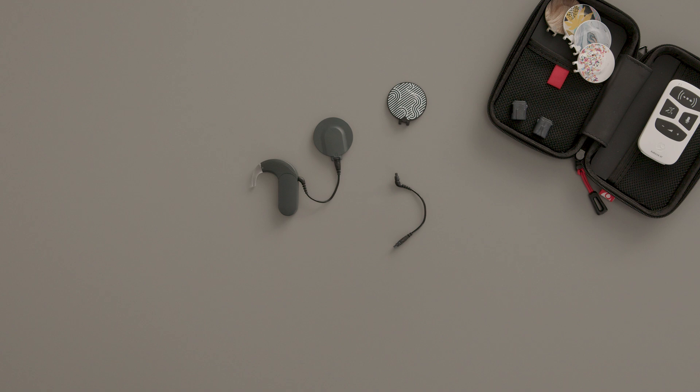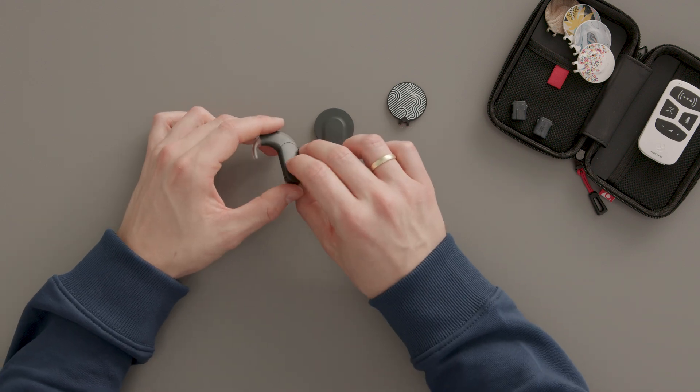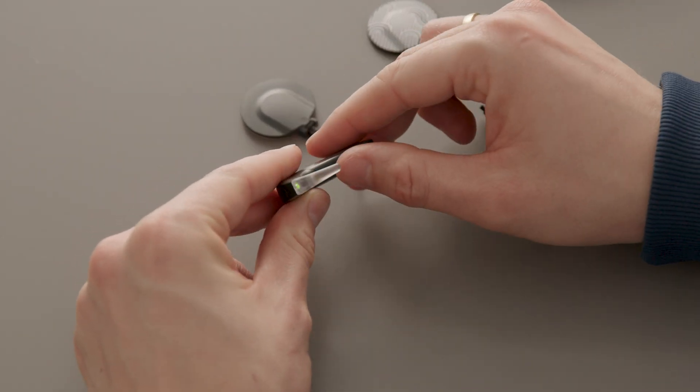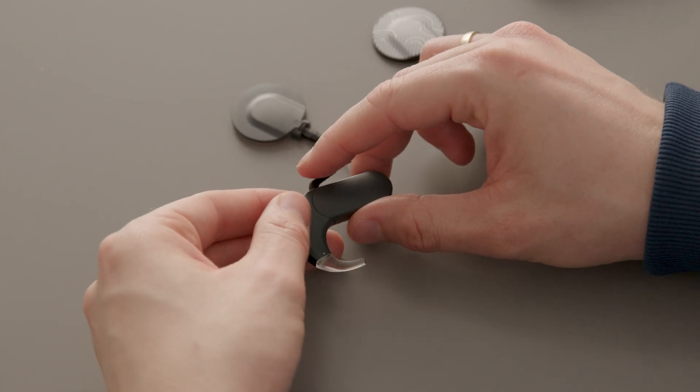To detach the coil cable from the audio processor, first remove the battery pack cover. Make sure the battery pack cover lock is in the vertical, unlocked position. Then slide the cover off the battery pack.